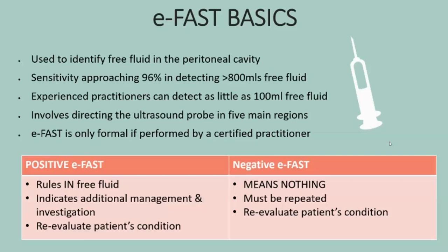EFAST is only formal if it's performed by a certified practitioner. So a very important thing that we need to use in our documentation is to actually document and write that it's not a formal ultrasound and that we are unaccredited practitioners when we do the ultrasound, just to medico-legally protect ourselves. So a positive EFAST can rule in free fluid.